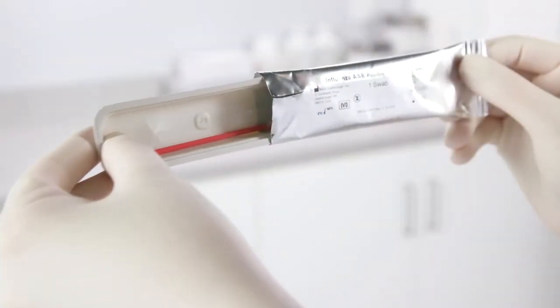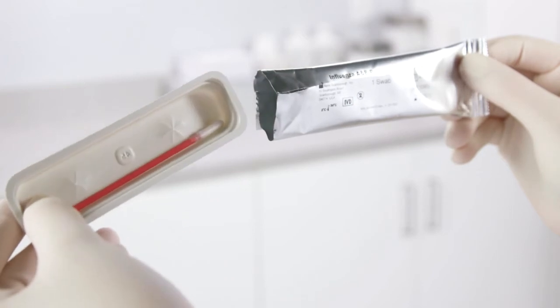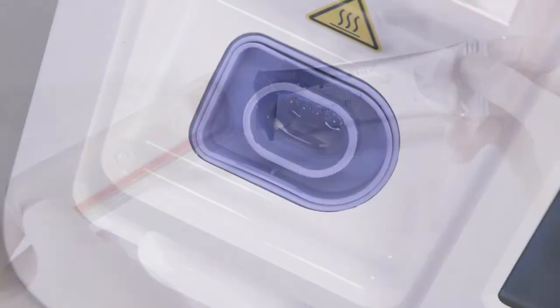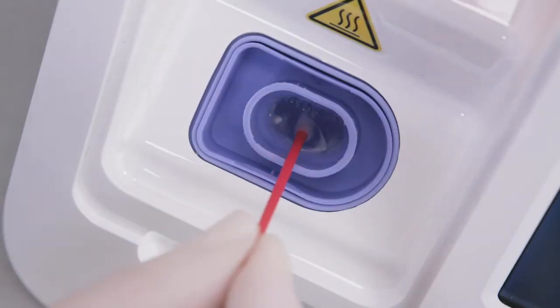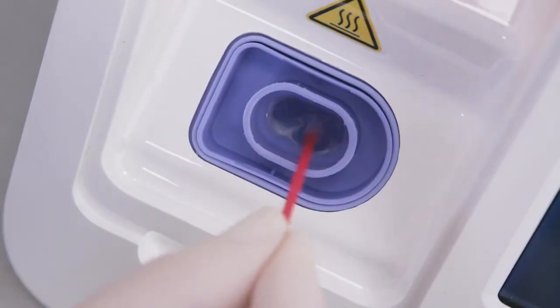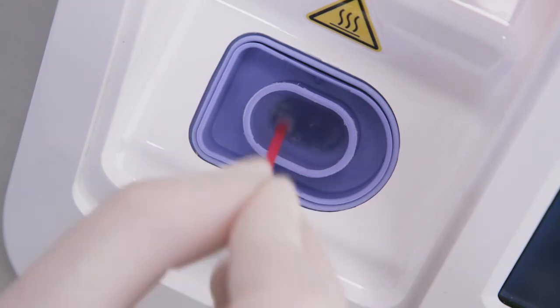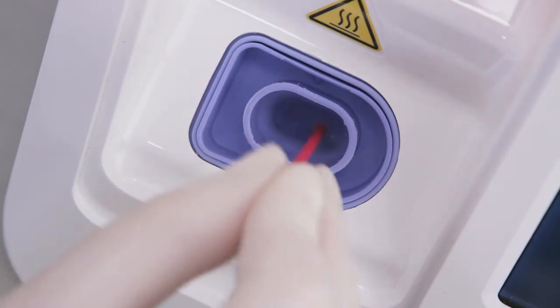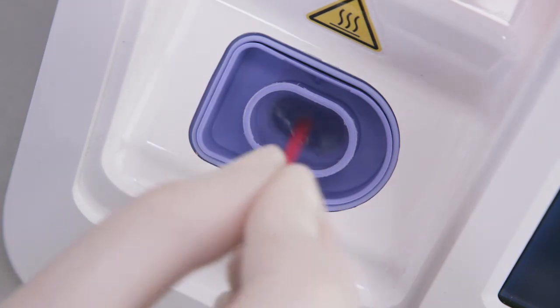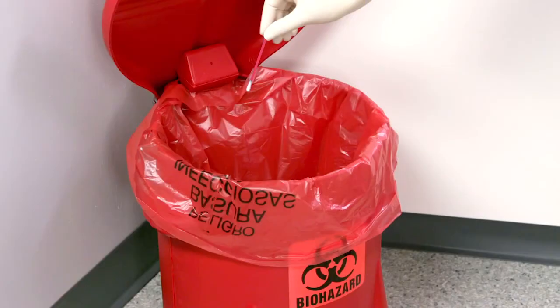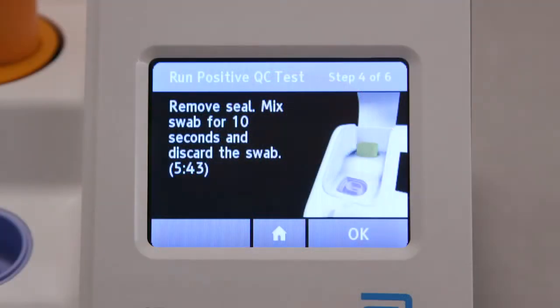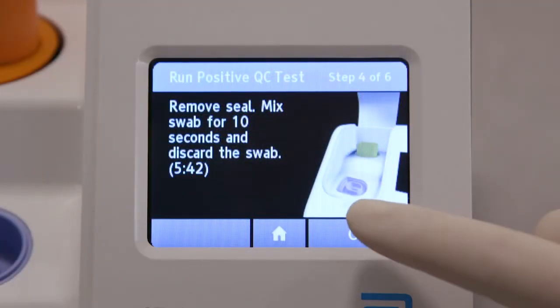Remove the control swab from the individual foil pouch. Press the swab head against the side of the sample receiver and vigorously mix the swab in the liquid for 10 seconds. Then discard the swab. Press OK.